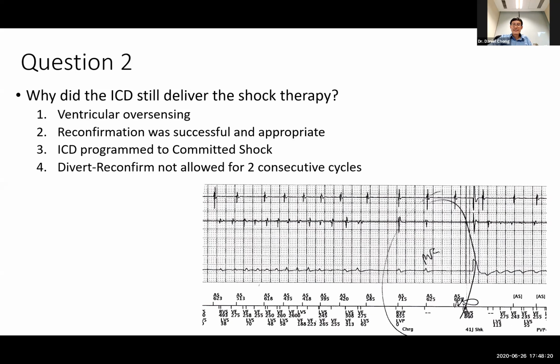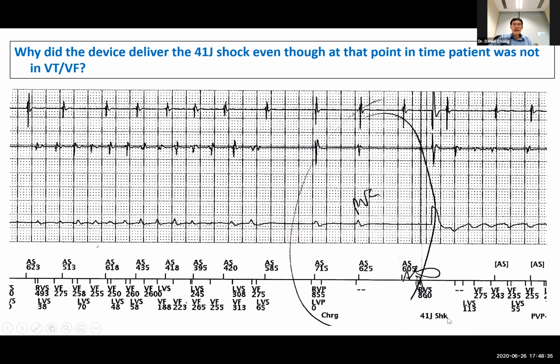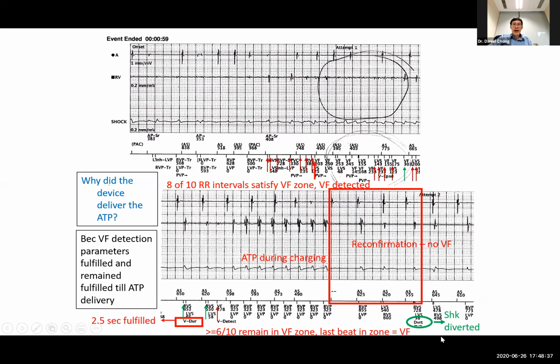Okay, so it's not committed shock, because in the earlier slide we can see that the shock was diverted. This is the earlier slide over here, and you can see in this earlier slide that this shock was diverted. Therefore, this ICD was not programmed to committed shock mode.